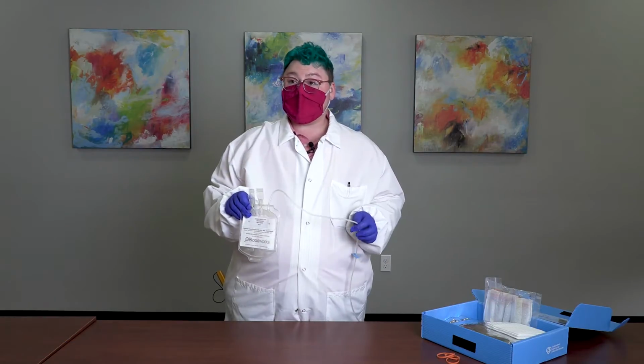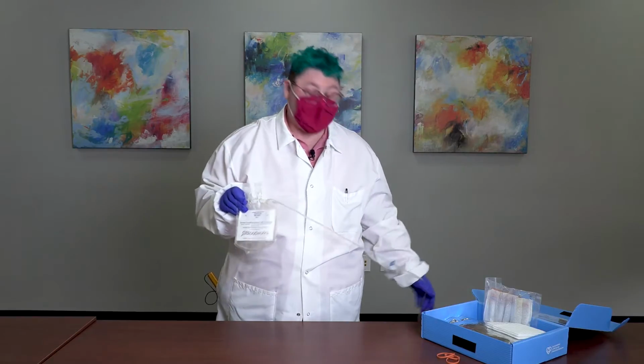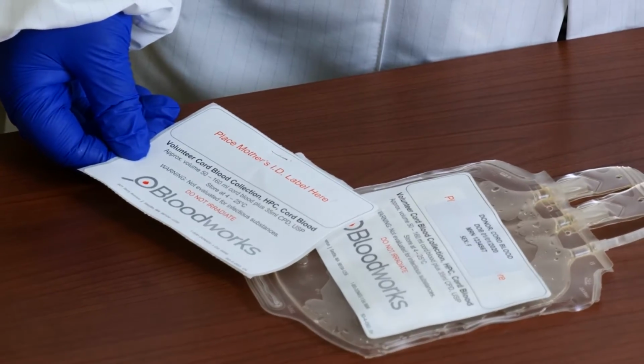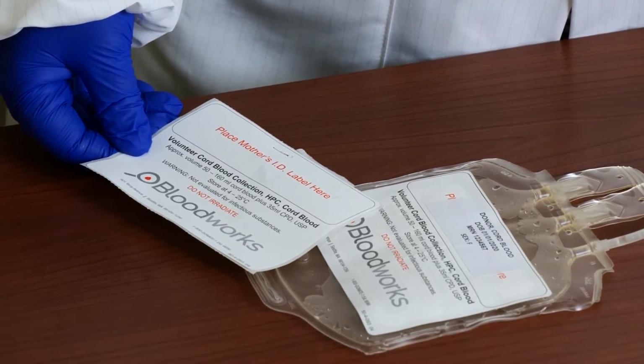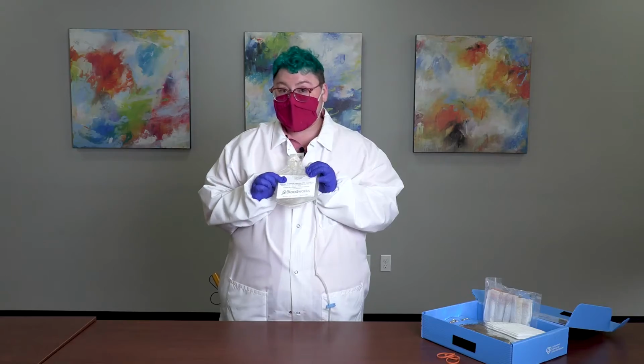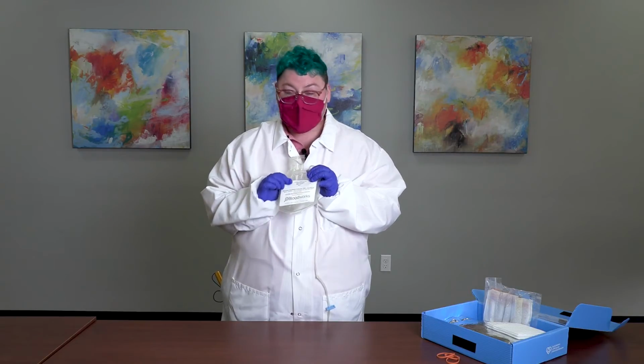Once your cord blood has been collected, 2 tight knots added to the tubing line, and the needle discarded, verify that the base label and the patient's hospital label is on the collection bag. As mentioned previously, without this information, we do have to discard the unit, and all your hard work will have gone to waste. Once the cord blood has been collected and the paperwork has been filled out, the donation is ready to come back to Bloodworks Northwest to our cell processing lab.